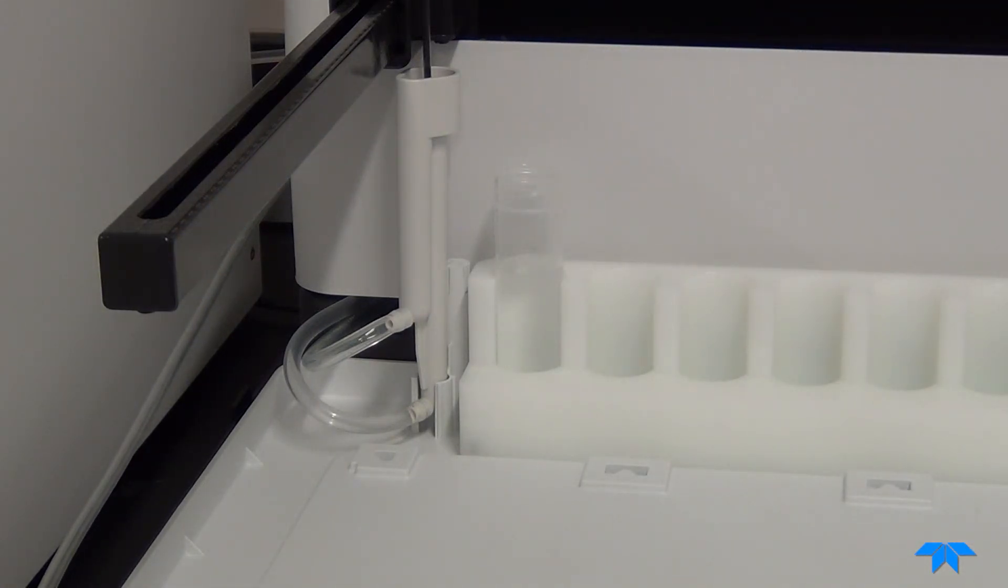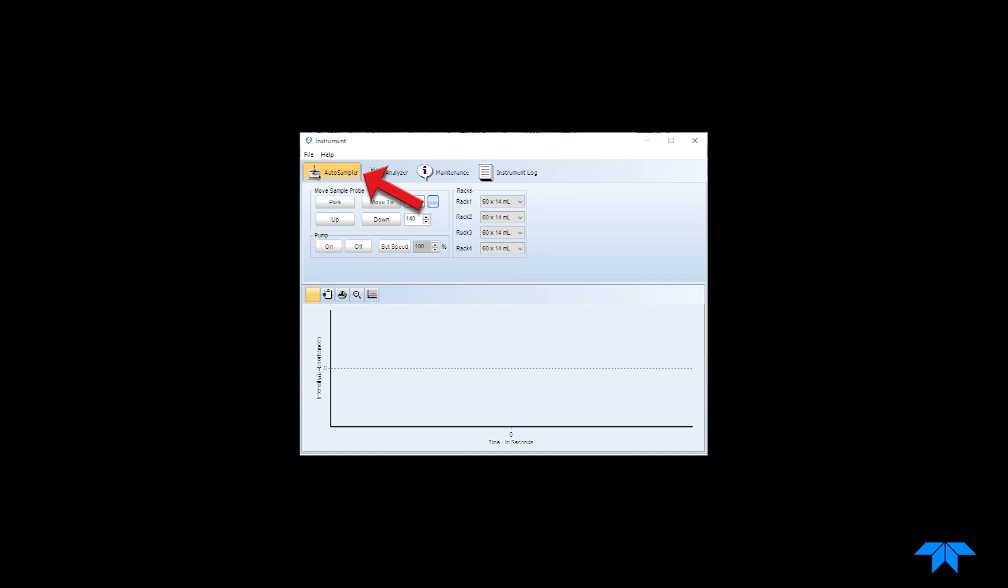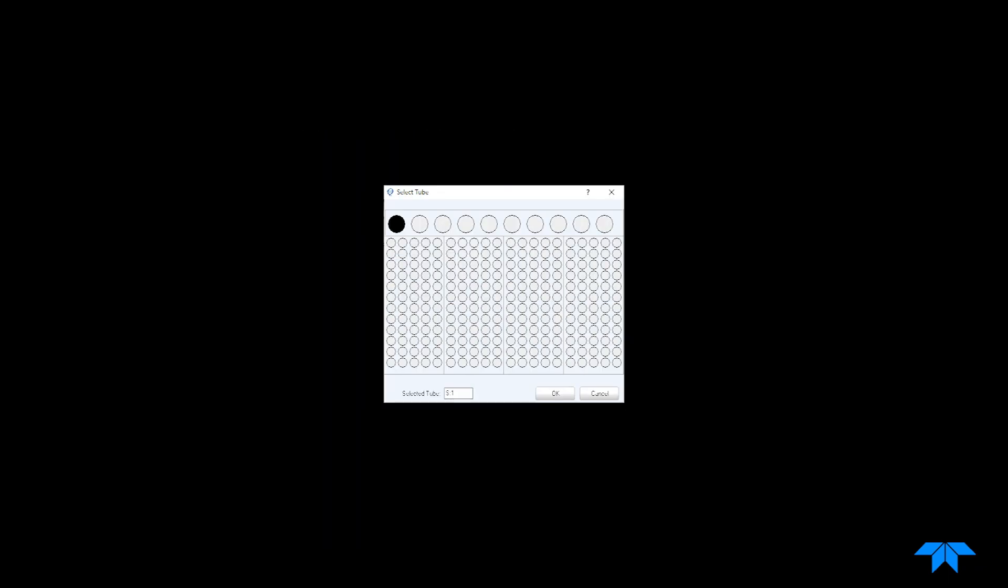In the instrument controls tab of the QuickTrace software, select the autosampler tab. Click on the ellipses button located in the move sample probe section. This will open a diagram of the autosampler positions. Select the position of your container, then select OK.